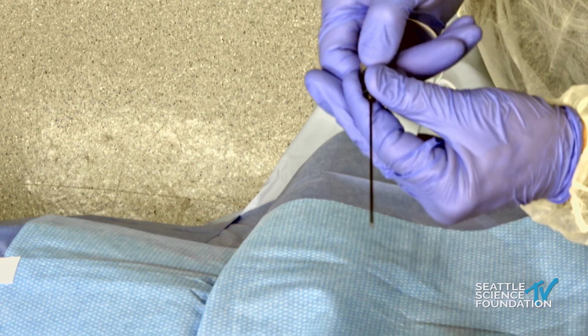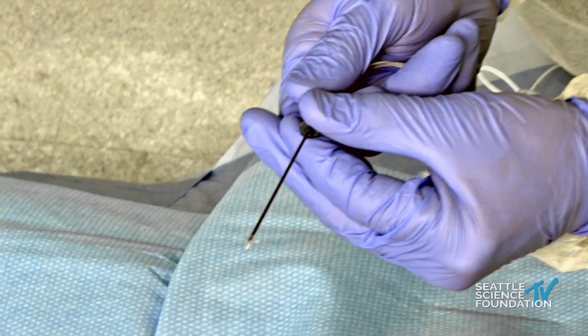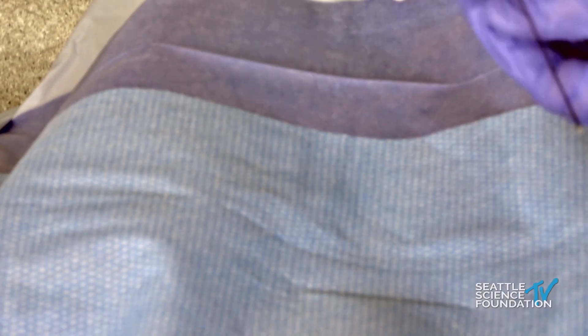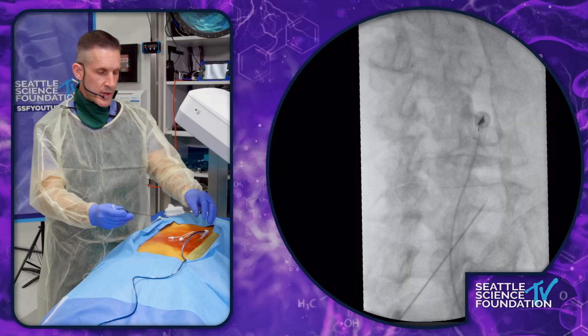Once you get into the space, you just turn this little gray knob. Those little tines open up and make kind of a bell-shaped lesion. So you're going to get a better lesion size than standard RF, but it's a more cost-effective way of doing this.